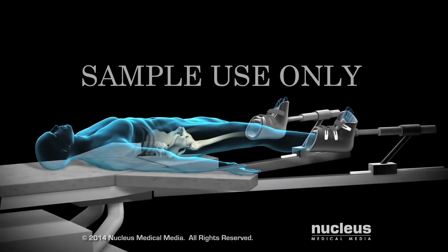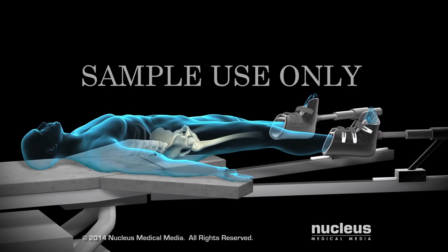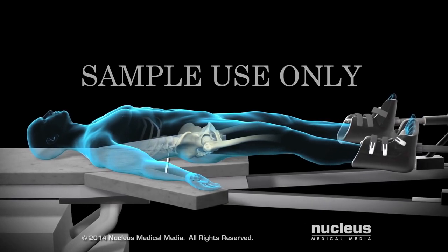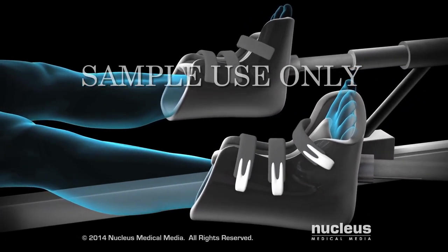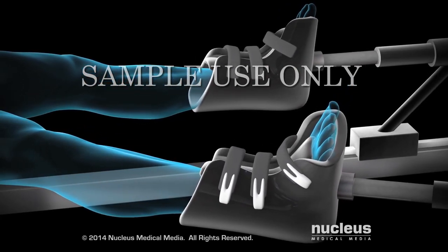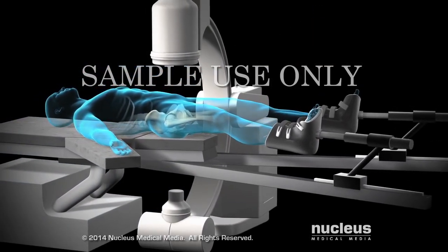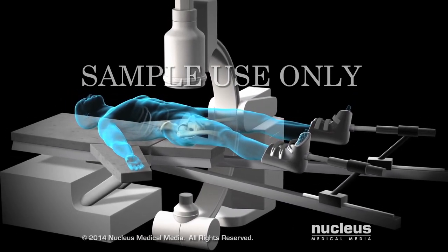During a direct anterior total hip replacement procedure, you will lie on your back on a specialized table, enabling your surgeon to perform this minimally invasive operation. Your feet will be placed in boots attached to the table, allowing your surgeon to position your legs as necessary to gain access to your hip joint. A fluoroscopy machine may be used during the procedure to help your surgeon position your prosthesis more accurately.